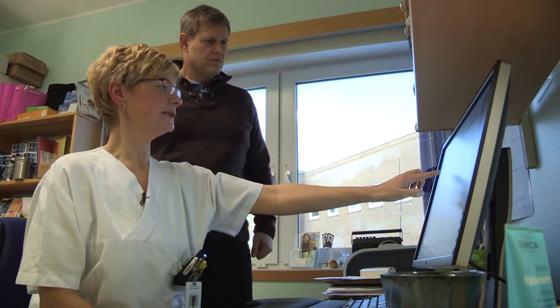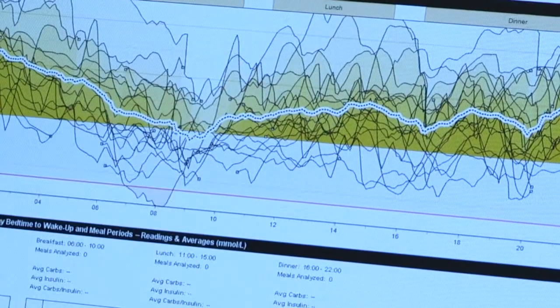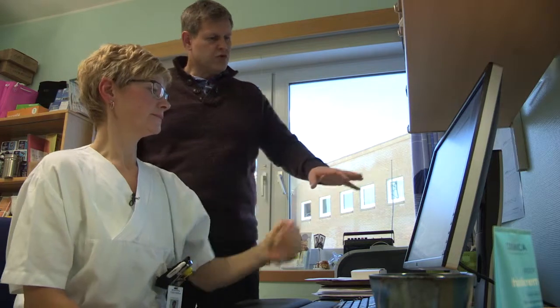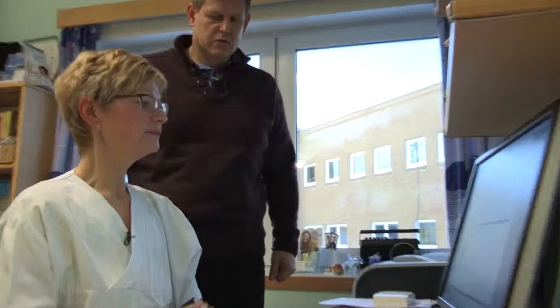And if the average was good here in the day or just high in the night, they can say, okay, you have to increase your doses at the pump in the night. But there's no way you can see that in real time without the patient giving you that information. I have to download from the pump when the patient comes here. Yeah, right. But the patient can't send that information with their mobile phone or any way else? Not from the mobile phone. Some of the patients have a patient version that they can download at home and send to me by mail, but not on the mobile phone.